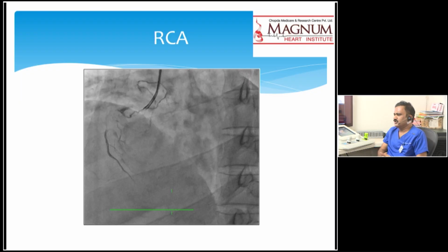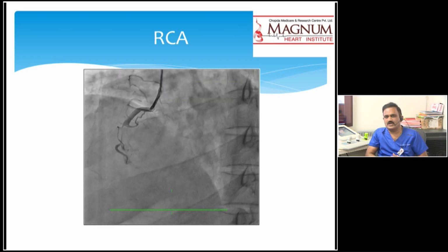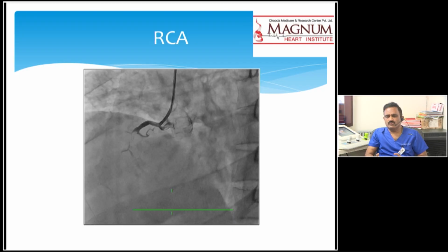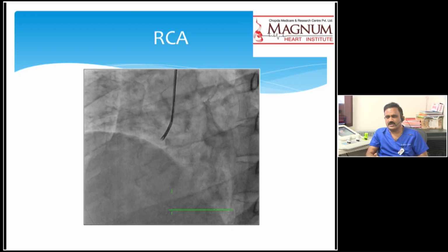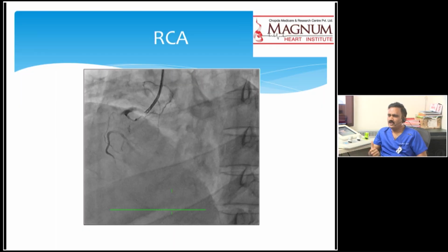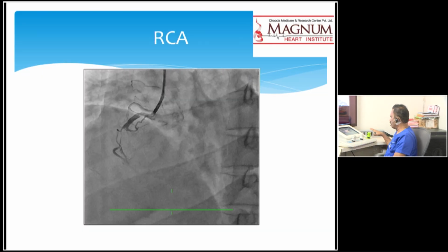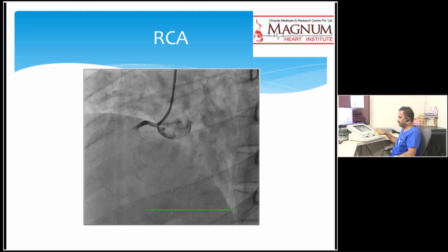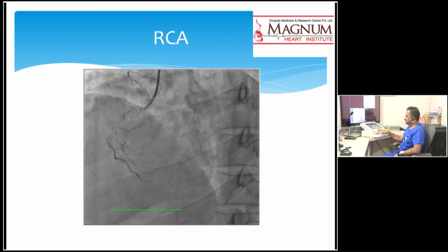And what I am going to do today is show you how to do a robotic angioplasty in a CTO case, and basically how to cannulate the RCA using the guiding catheter, then taking the wires, and basically we have a console here. There are 3 joysticks. The rightmost is for the guide catheter, the midway is for the guide wire, and this one is for balloons and the devices.